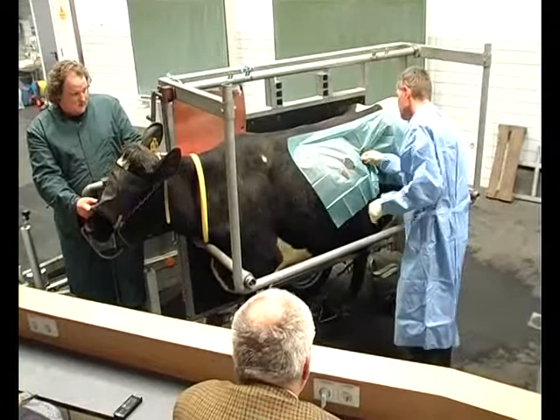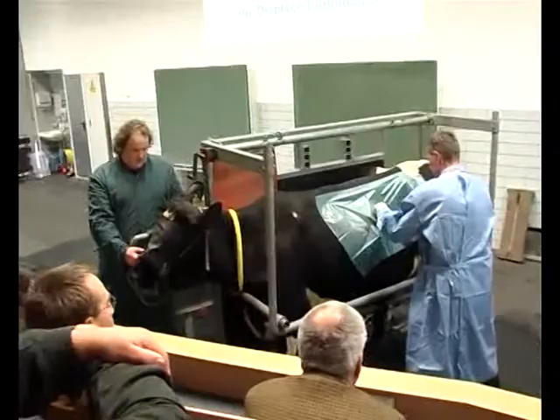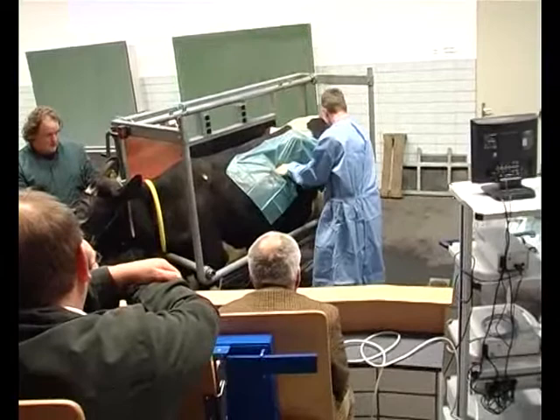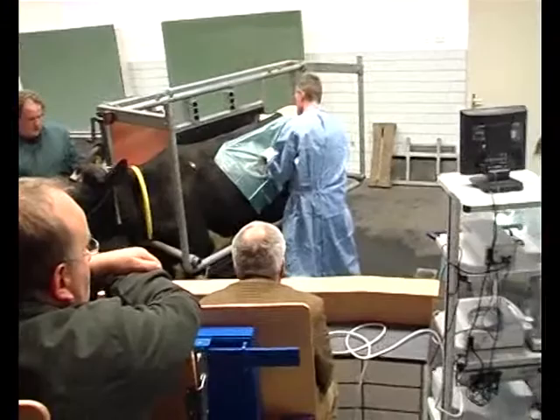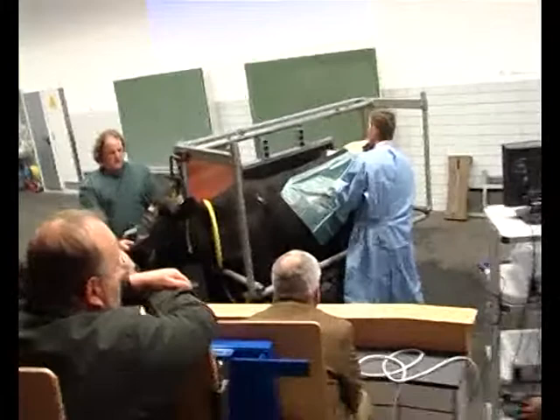Well, I think I will try now with the endoscope. You can hear the air go inside now.